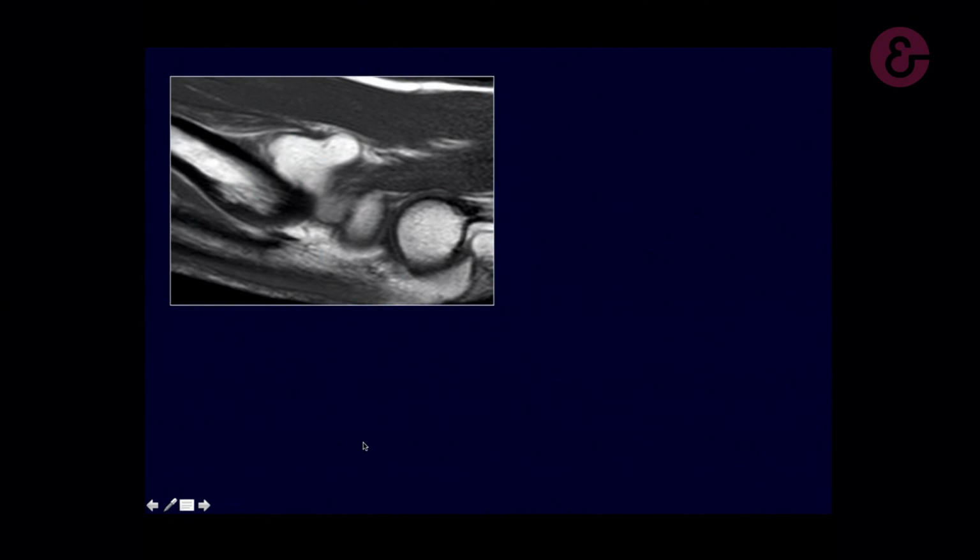And since it was the wife of my friend, I performed the MRI, and it is exactly the same. You can see the lipoma arising from the deep aspect, from the periosteum, and this is maybe, I don't know, the nerve, and this is the Frohse arcade. And the lipoma is compressing itself against the arcade, compressing the nerve.